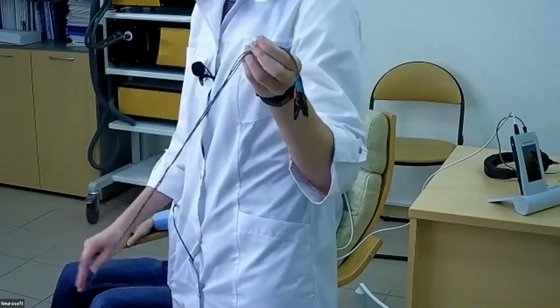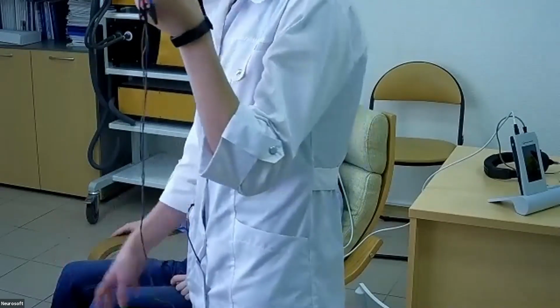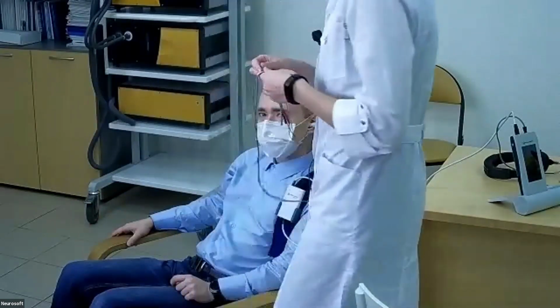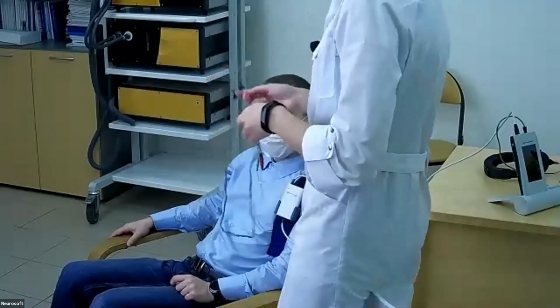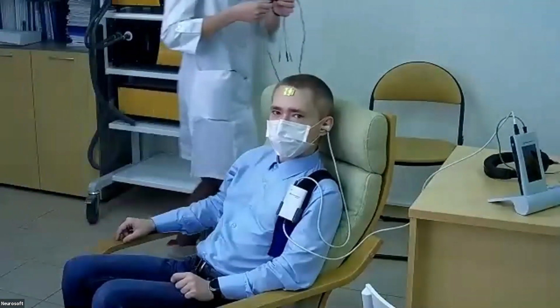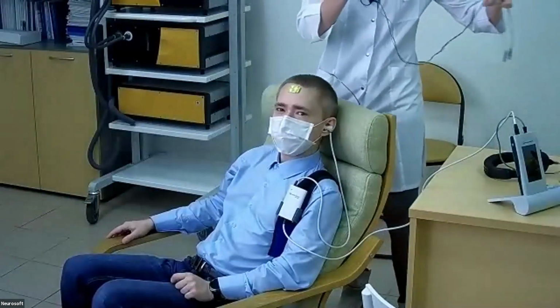I twisted the cables again to reduce the electromagnetic noise.